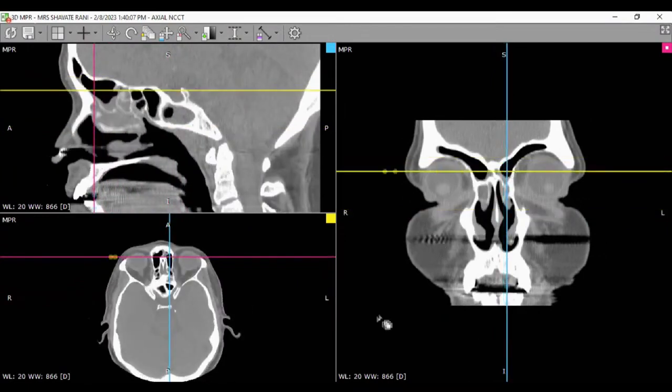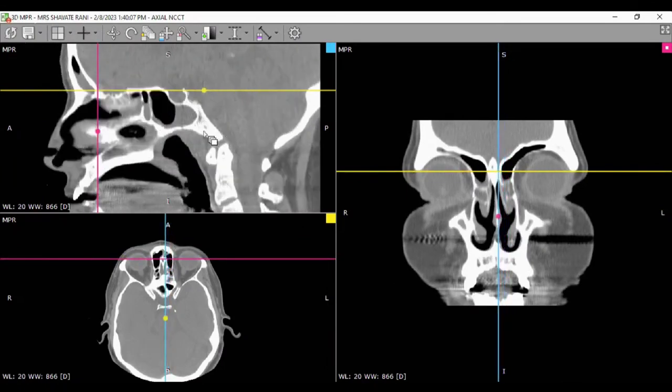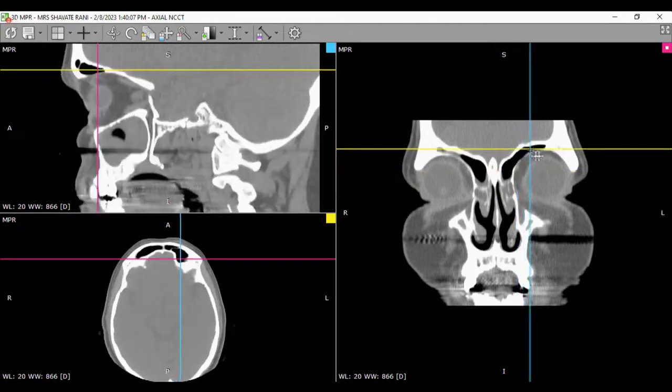See this, this is supraorbital pneumatization. The frontal sinus is left far anteriorly. So that is something. See, the frontal is left behind. This is the orbit. This is the supraorbital cell. Wide pneumatization of the supraorbital cell.